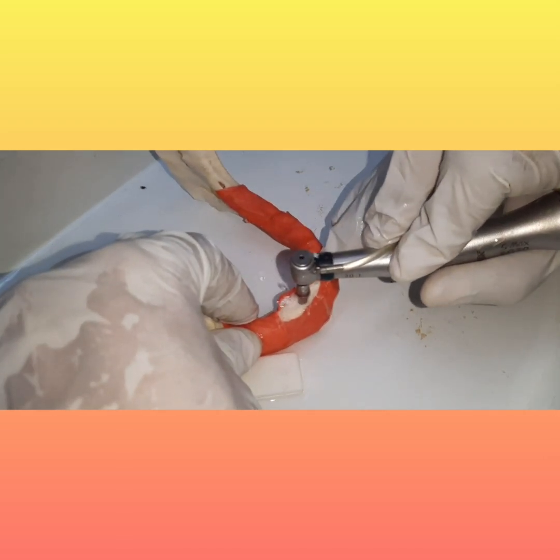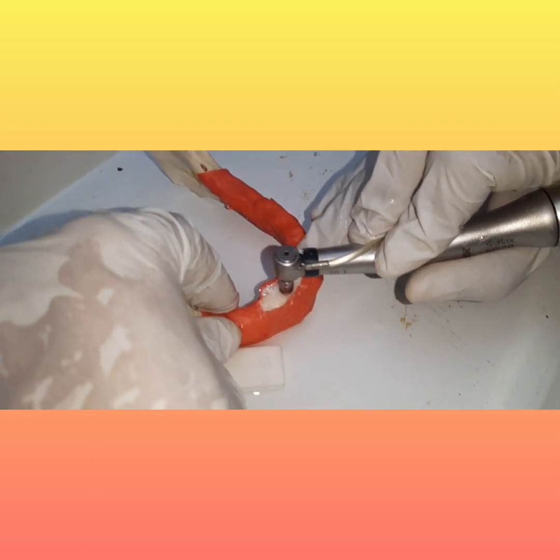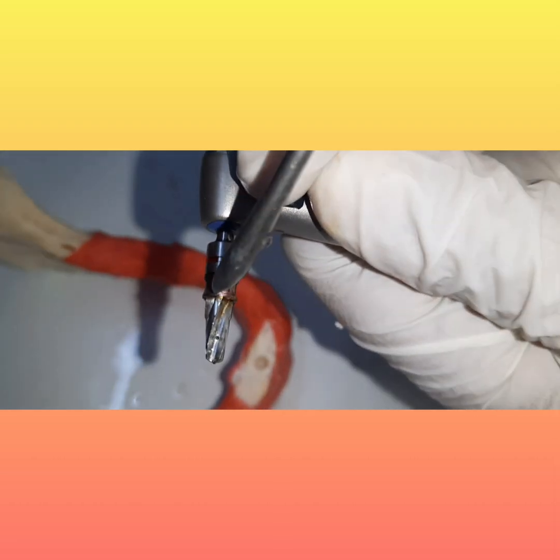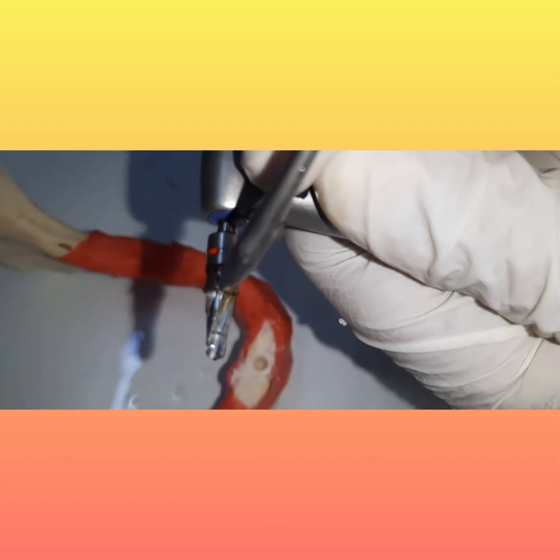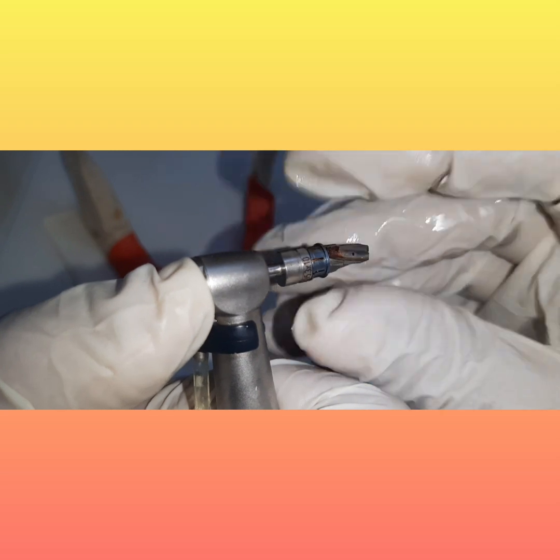Okay, so we have this. Here we have the stopper in, and go till the stopper should stop at the level of the bone. So the stopper stops here. This should be at the level of the bone. This rim should be at the level of the bone here. Next we take the final drill.